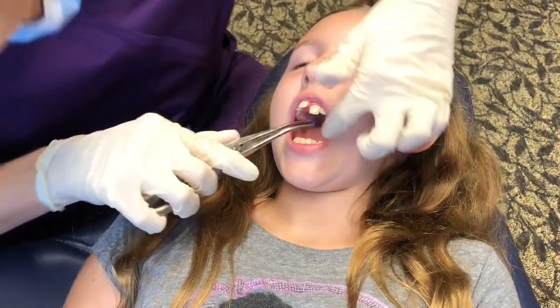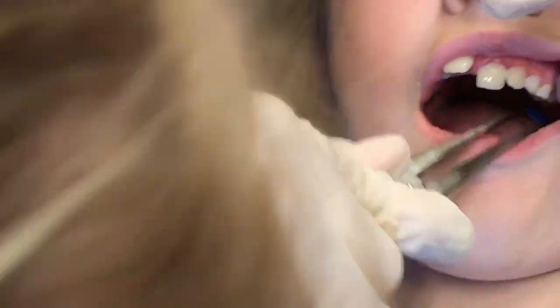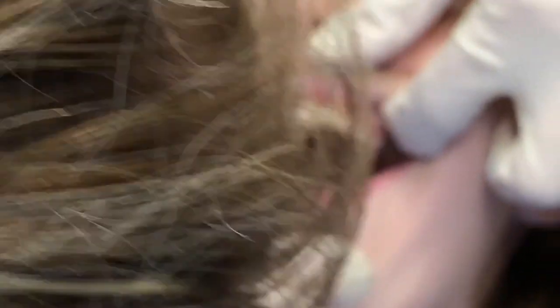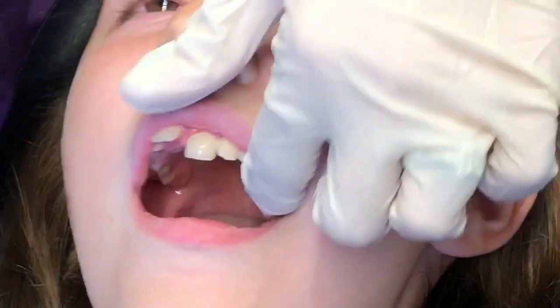Open. Will it hurt? Nope, nope. It just feels like chicken in your teeth or something — like food, basically. Open real wide for me. Good. That's it. Not bad, right?